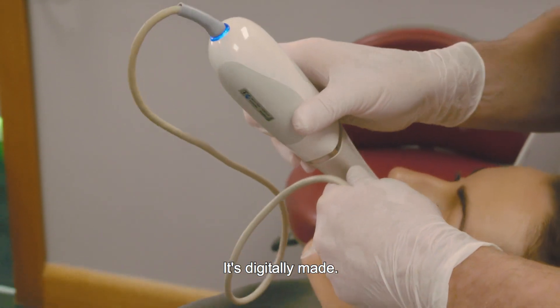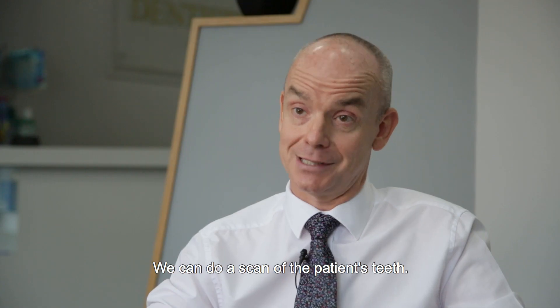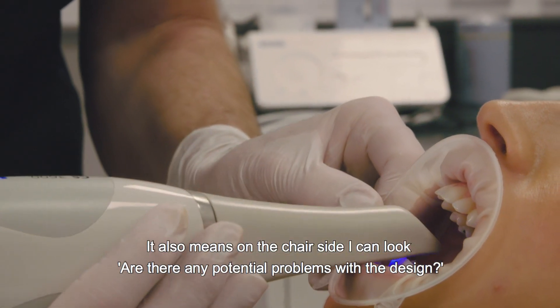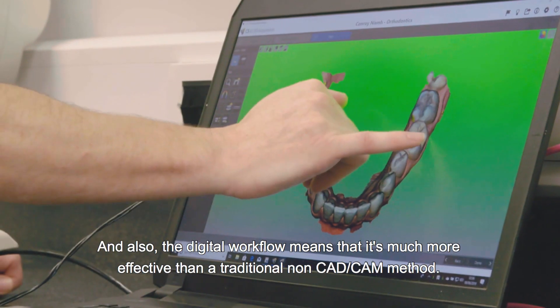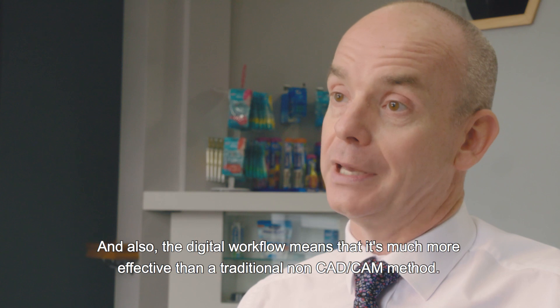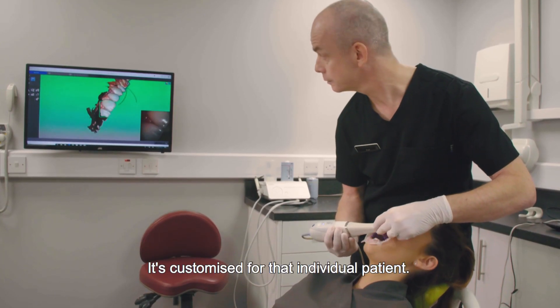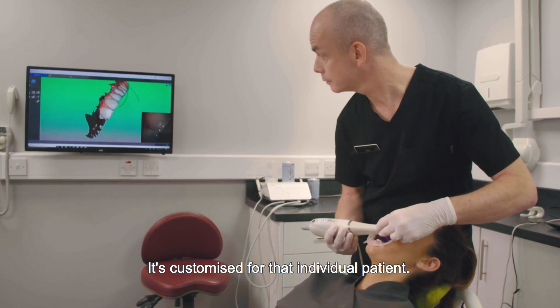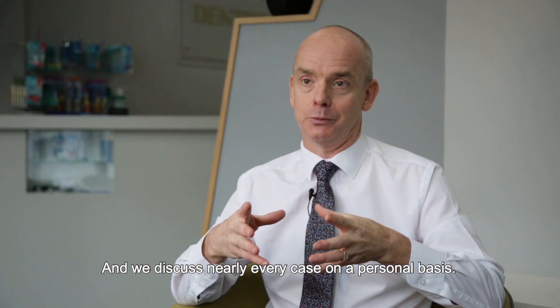It's digitally made — we can do a scan of the patient's teeth. It also means chairside I can look at whether there are any potential problems with the design, and the digital workflow means that it's much more effective than a traditional non-CAD/CAM method. It's customised for that individual patient and we discuss nearly every case on a personal basis.